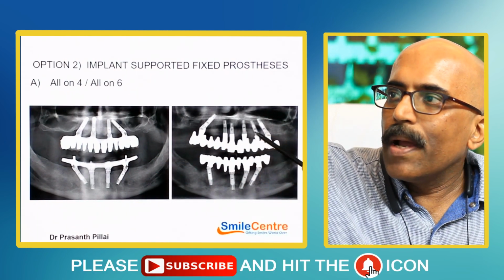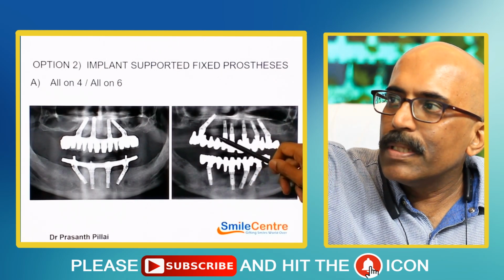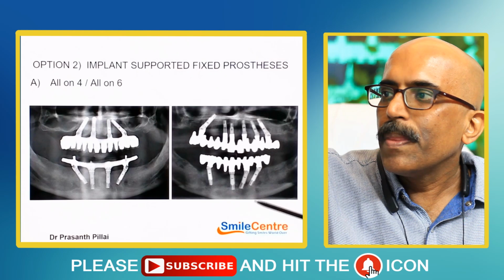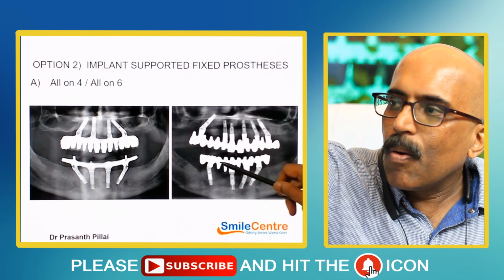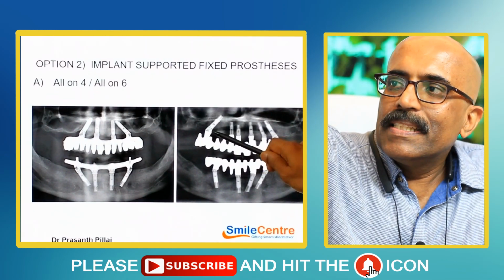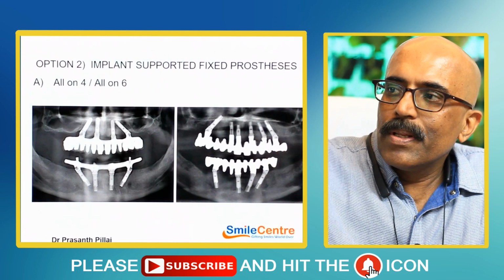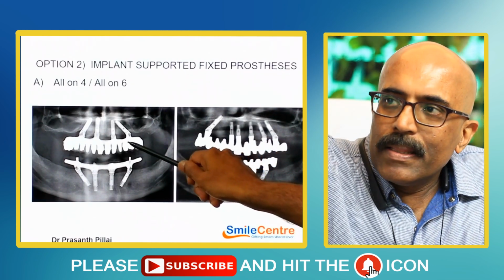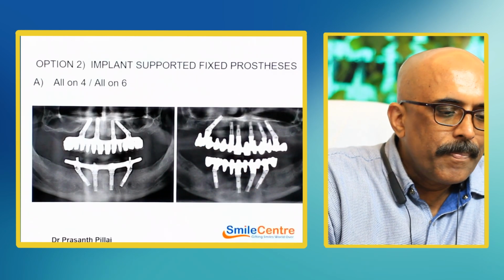All-on-6 is when you have 6 implants, and then you take support of all the teeth from the 6 implants in each jaw. So here in this situation, you have an all-on-6 on the upper jaw and all-on-4 in the lower jaw. So this is an all-on-6, as you can see, in the upper jaw, and you have all-on-4 in the lower jaw. And in this image you can see all-on-4 in both the upper and lower jaws.